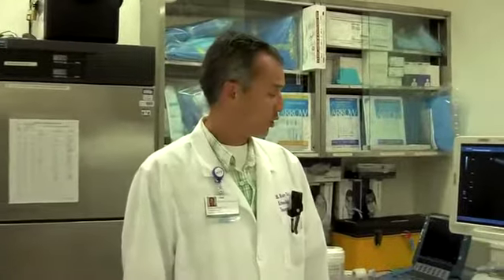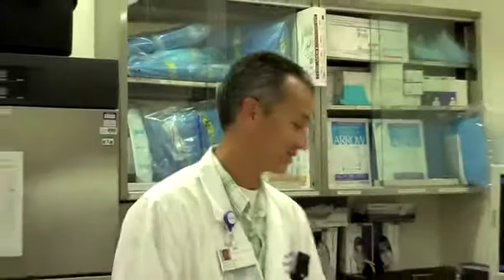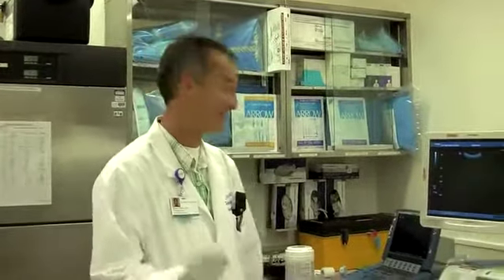All right, first thing I'm going to go over is when you first approach the machine, which also means when you first come on shift, you've got to make sure the machines are clean and ready to go. Normally, when you approach one of these machines, because the last student didn't do a very good job, and you should reprimand them for this, I would approach the machine with gloves on, because these things are disgusting. You never know where these probes have been, you know what I'm saying?